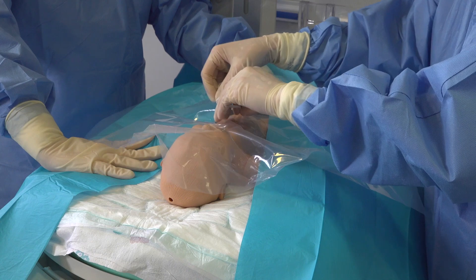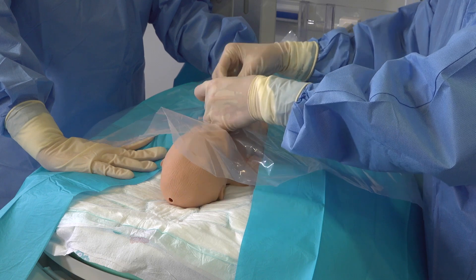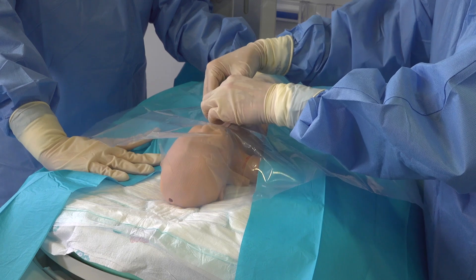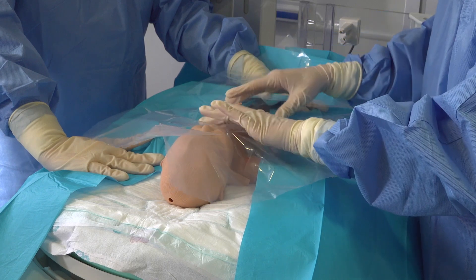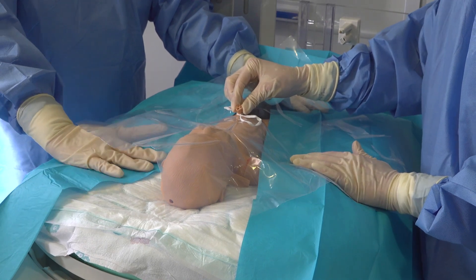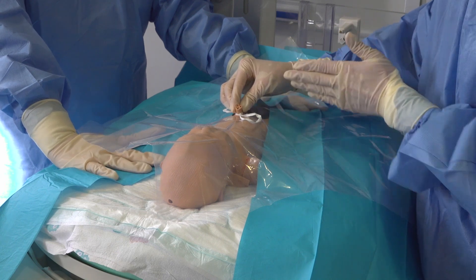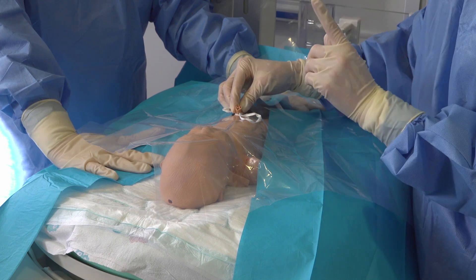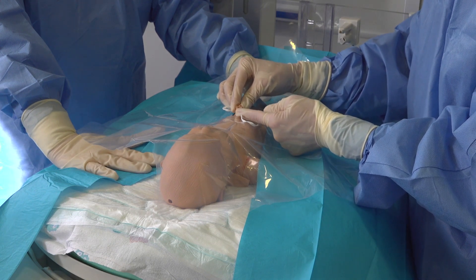I start by placing my cord tie around the base of the cord, trying to ensure that it stays off the baby's skin, and pulling it nice and tight so that no oozing will come from the vessels whilst doing the procedure. Now you identify which is your vein and which is your arteries. Your arteries — you have two of — and they generally sit towards the feet area. They generally have thicker walls, are more pronounced and upright than your vein, which has thinner walls and can sometimes sag a little.